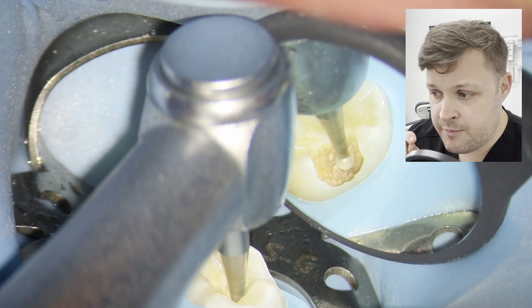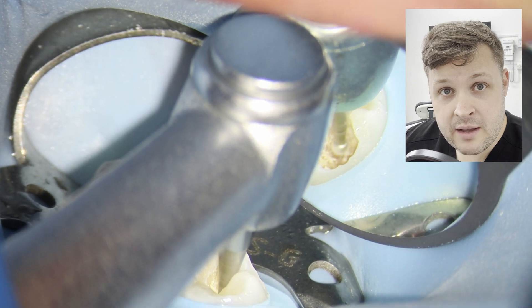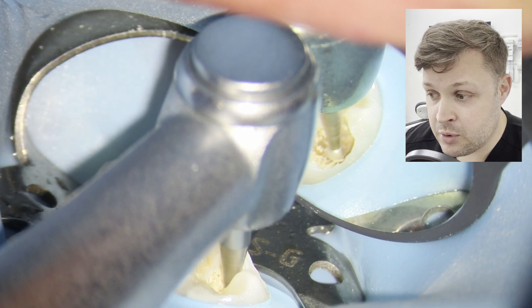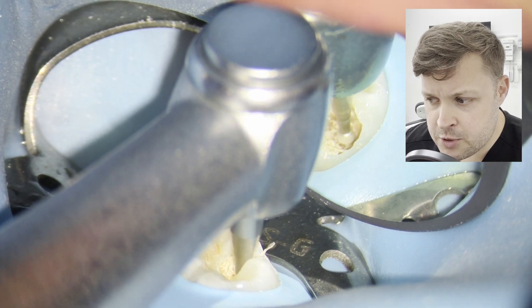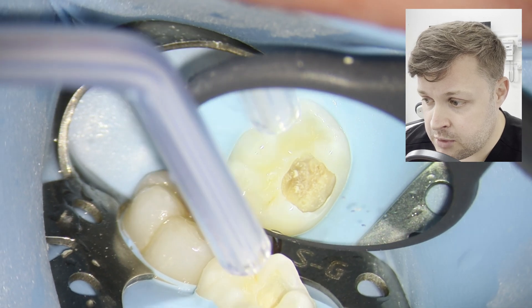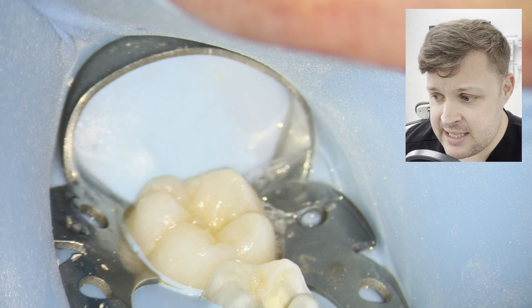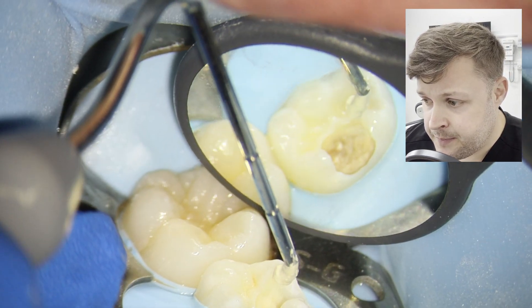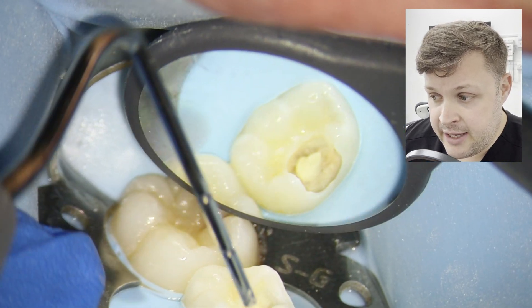This is much easier with a microscope. If you're doing this with loupes or just the naked eye, you really risk exposing the pulp, so you have to be super careful. I'm being very gentle with the drill, just inspecting the cavity, and in this case I actually managed to remove all the decay, which was fantastic.